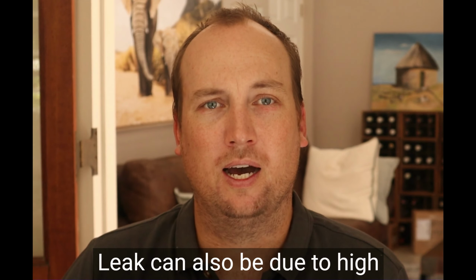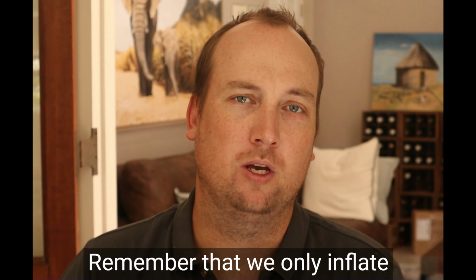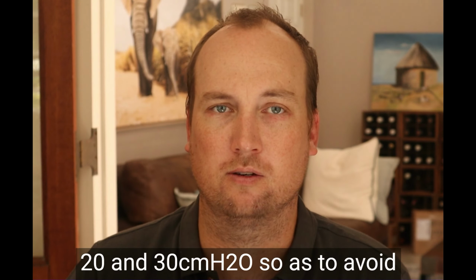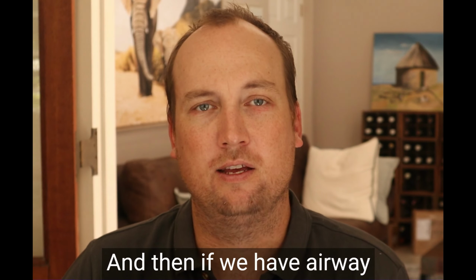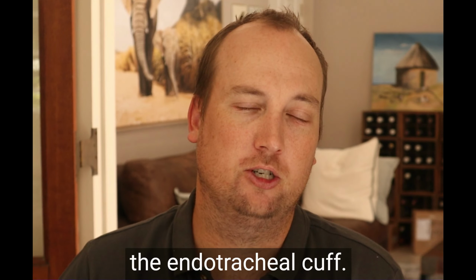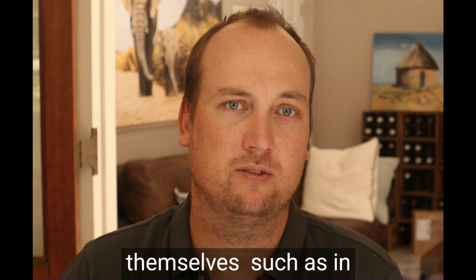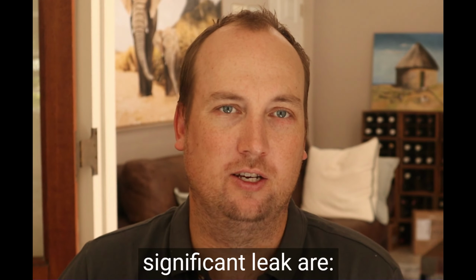Leak can also be due to high airway pressures that cause leak past the endotracheal cuff. Remember that we only inflate our endotracheal cuff to between 20 and 30 centimeters of water, so as to avoid damage to the trachea itself. And then if we have airway ventilatory pressures that are above this cuff pressure, then there will be leak past the endotracheal cuff. There can also be leak from the airways or the lungs themselves, such as in alveolar or bronchial fistulae.